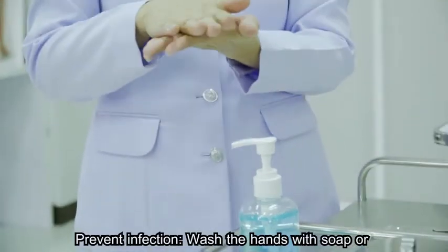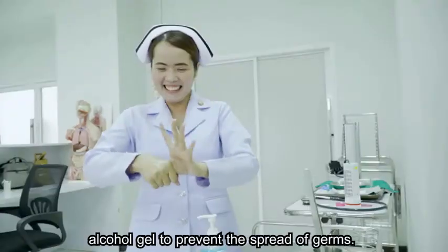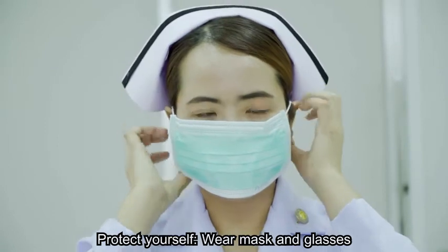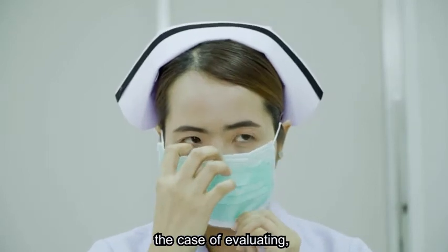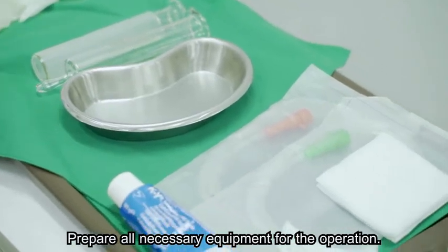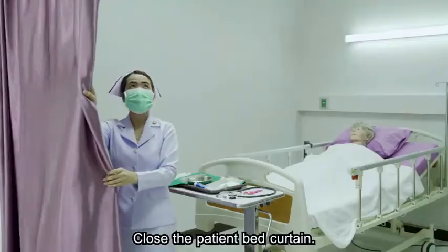3. Prevent infection. Wash the hands with soap or alcohol gel to prevent the spread of germs. 4. Protect yourself. Wear masks and glasses, in case the patient has a cough or diffuse secretions. 5. Prepare all necessary equipment for the operation. 6. Close the patient's bed curtain.